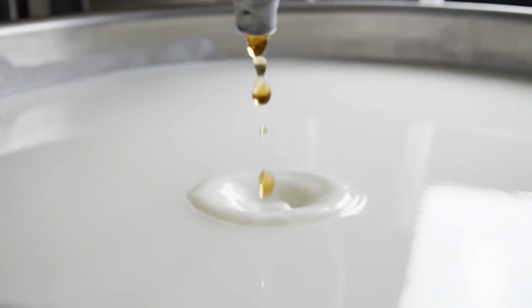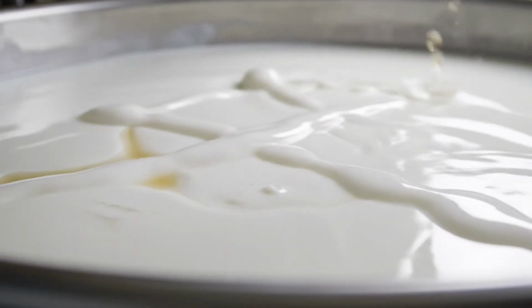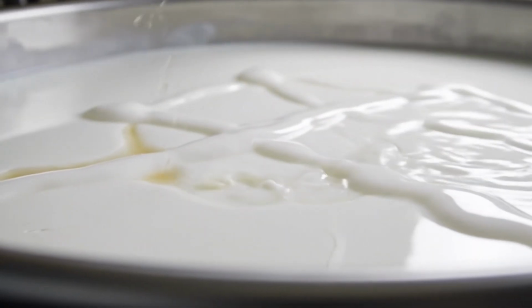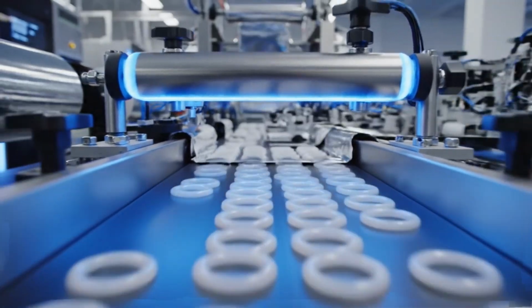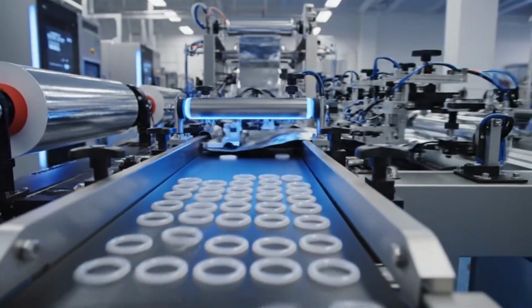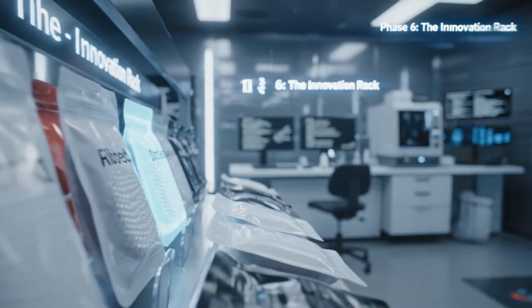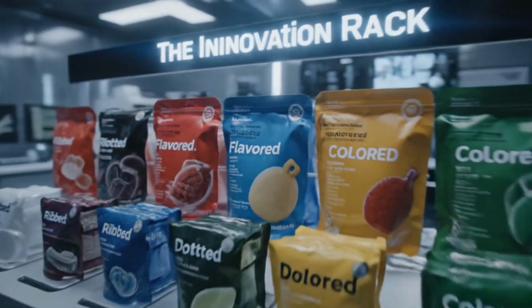We neutralize the natural scent of rubber, replacing it with subtle, inviting aromas. Static management is essential for high-speed automation. It ensures the product moves through the machines without friction. Phase 6 is complete. We have added the features that made our products unique.